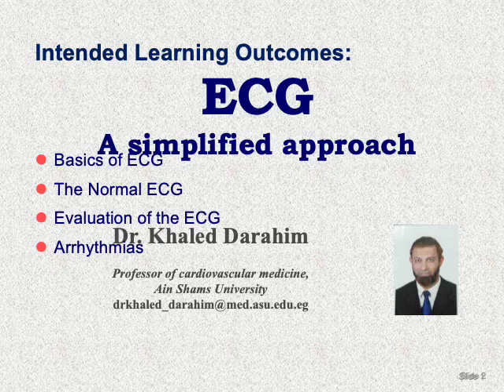Actually, the learning outcome for this lecture will be on two main subjects. First is the ECG basics, how to interpret the normal ECG and evaluation of the ECG so that you can get a report from the ECG recordings. The second one will be arrhythmias, and a simplified approach being a medical student.